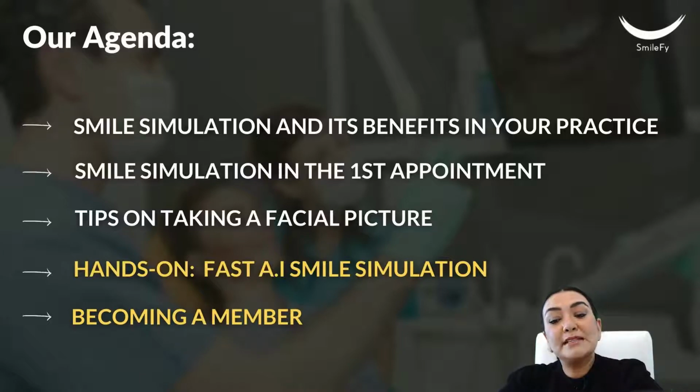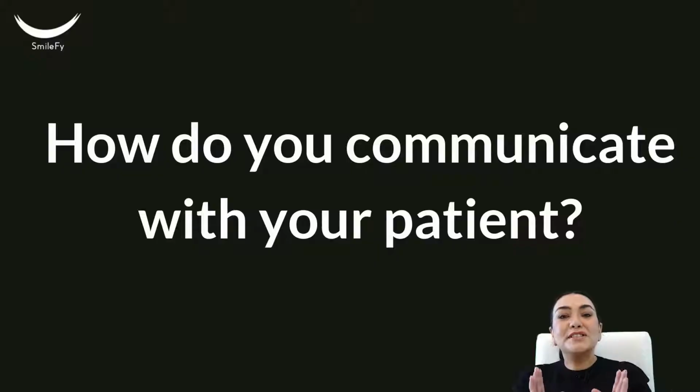You will do a smile simulation in the first appointment, and learn how to get the proper pictures to do that. Also, we're going to have a hands-on during the webinar so you will see how easy and fast smile simulation is.